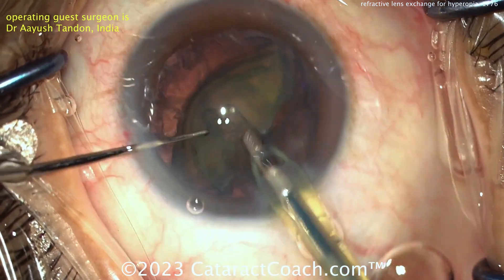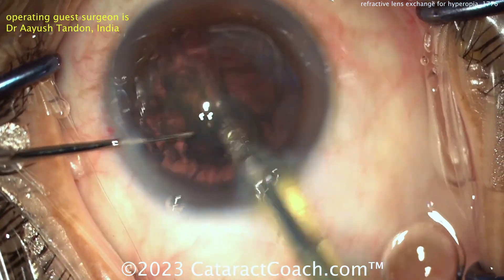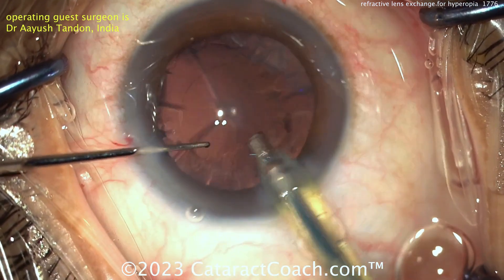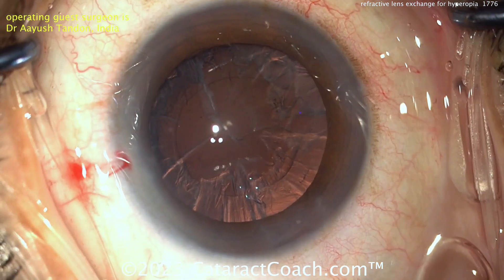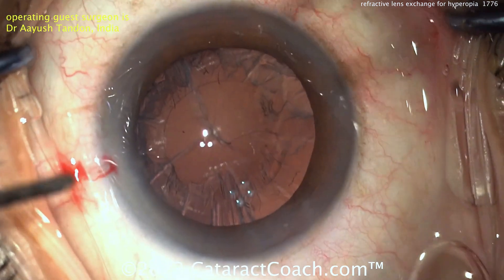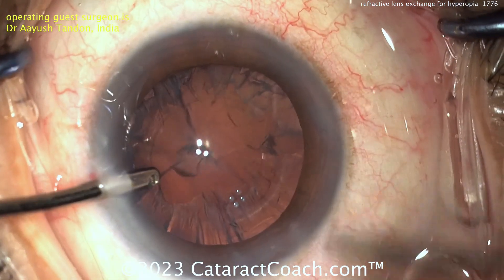You don't want to give too much energy because if you get the energy you'll break that vacuum hold. There it goes — aspirates out nice and easy. Time to clean up the bag, take out that cortex, and get that lens in.